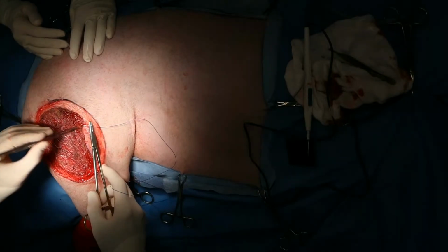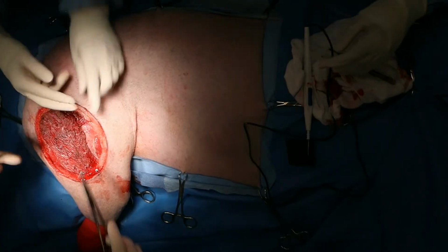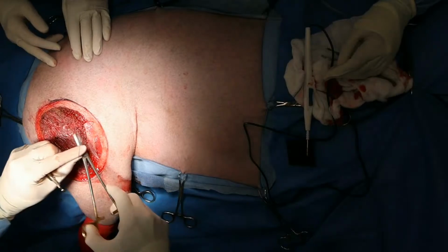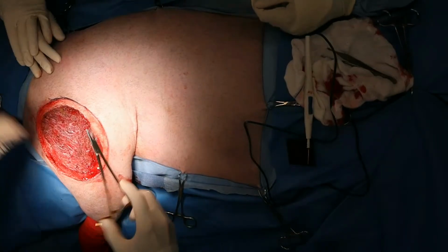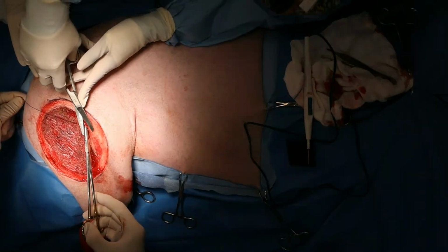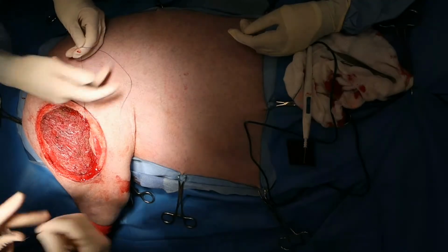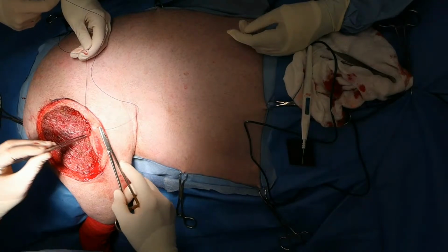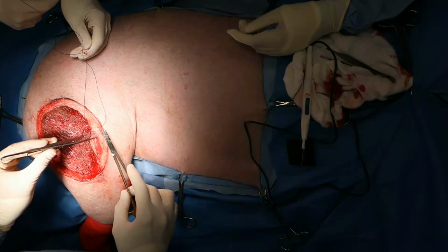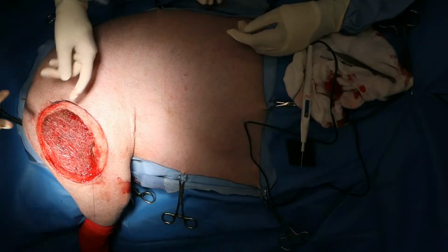So I'm just going to close that biceps to the fascia lata there. So other than a flank fold flap, guys that are watching, any other reconstructive options here? Any other axial pattern flaps that would be appropriate? So for the lateral thigh in a dog, we've got flank fold flap, which I think is the best one. That's why I'm doing it. But are there any other ones that anybody can think of?